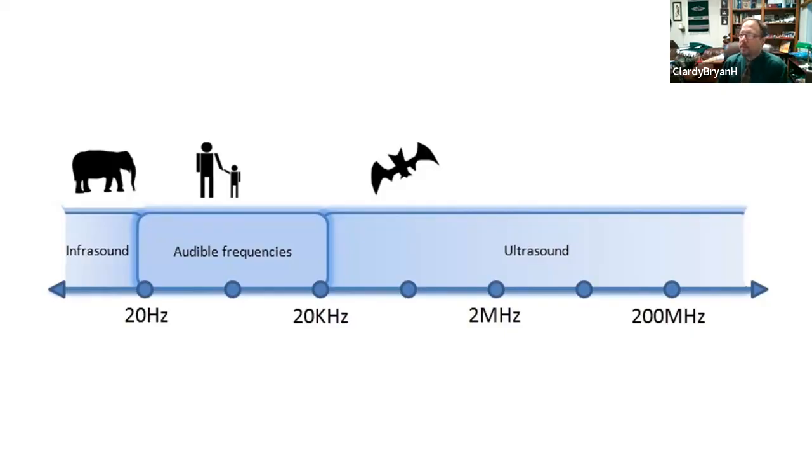and so it only functions within a few feet. And so what I really want you to take away from this is that the lower the frequency, the further you can go, but the higher the frequency, the more resolution you're going to get. So there's a trade-off in both directions. Next slide.